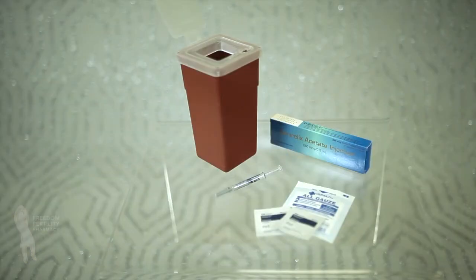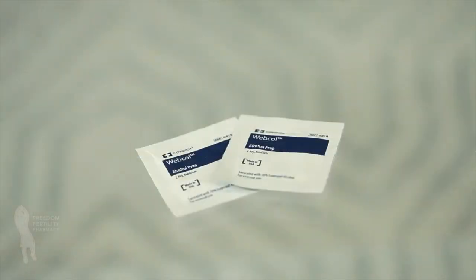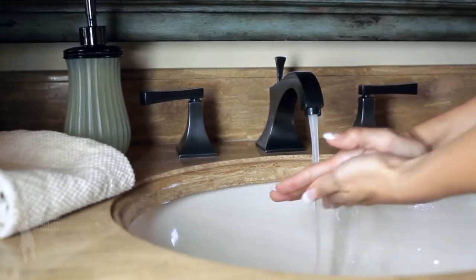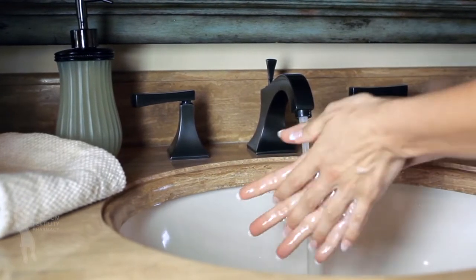Be sure to have all of the following items before you begin: one Ganorelix acetate pre-filled syringe, alcohol swabs, sterile gauze, and a safety container. Wash your hands with soap and water and dry thoroughly. Make sure you are working on a clean, flat surface.